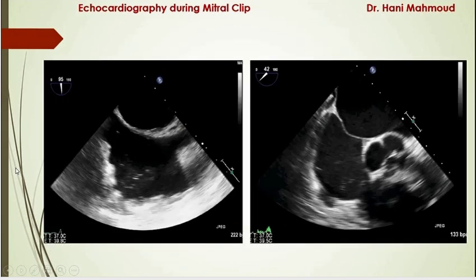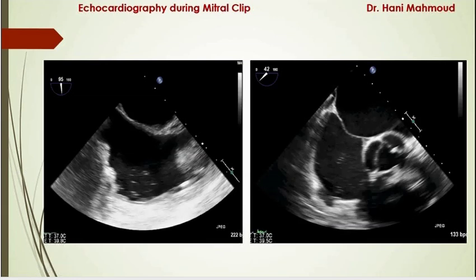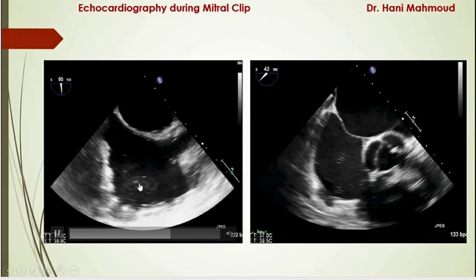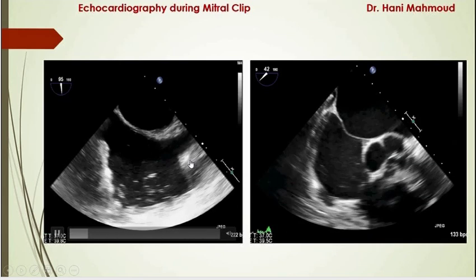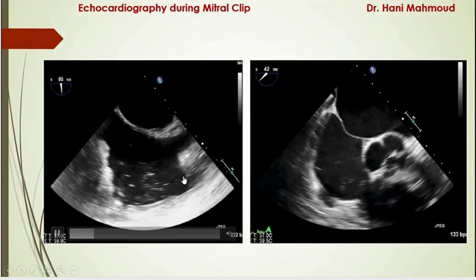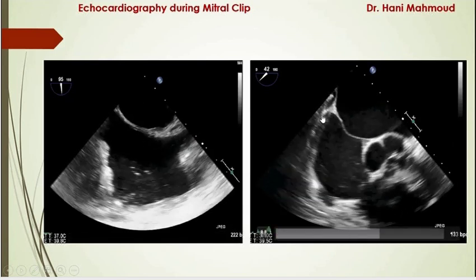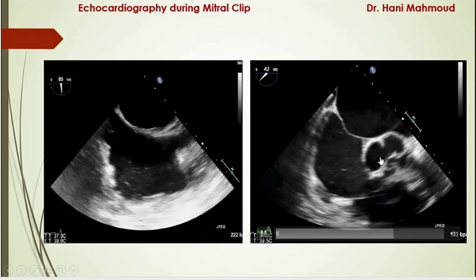We have to assess the intra-atrial septum very well before any procedure that includes septal puncture. This is the bicaval view, one of the longitudinal views from the mid-esophageal level. Here are the superior vena cava, inferior vena cava, right atrium, crista terminalis, right atrial appendage, and the left atrium. This is the short axis base view with the aortic valve in short axis.